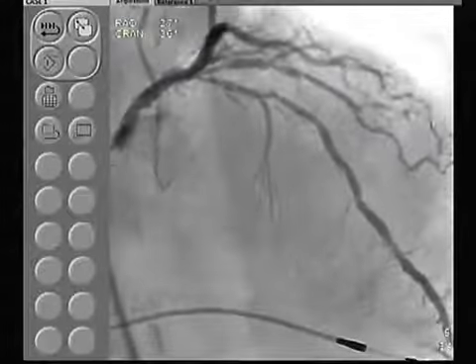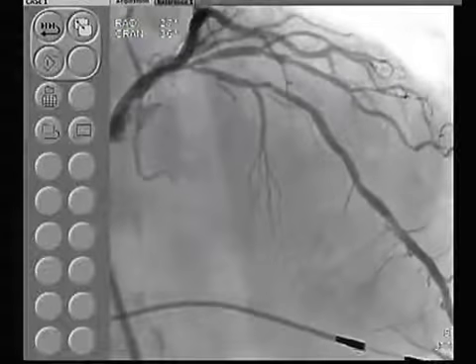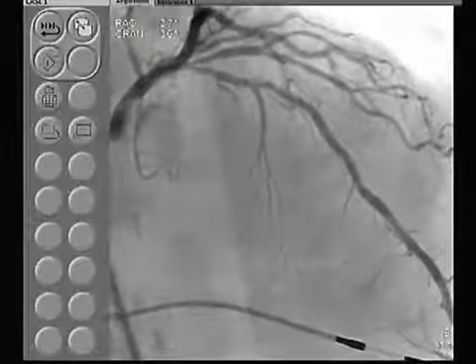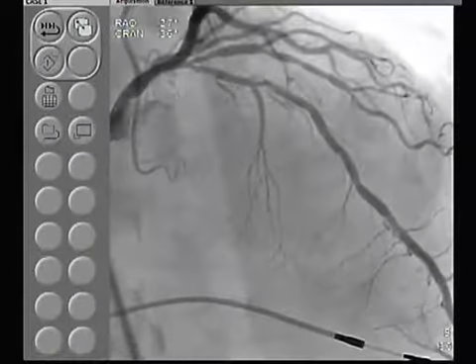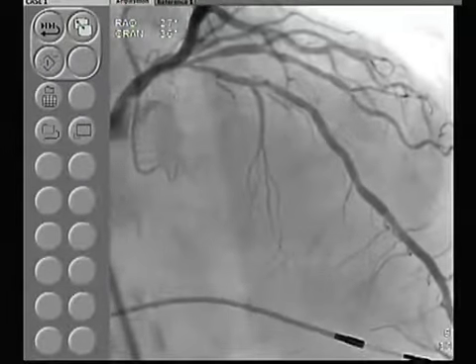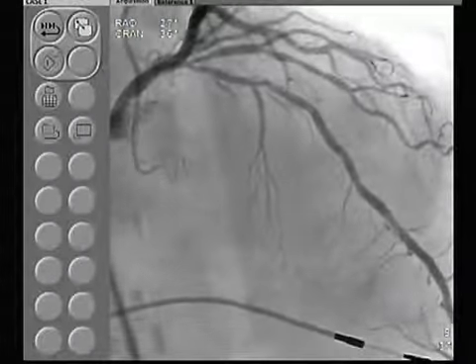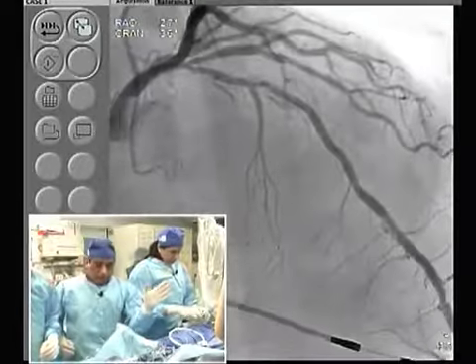Well, I would say in this particular case it would be reasonable, because for the mid LAD the calcium is the highest, just after the septal. In that area you need to be ready, having dilated and opened it up, whether you use a cutting balloon or an AngioSculpt, because a regular balloon may rupture. So you first need a non-compliant balloon.